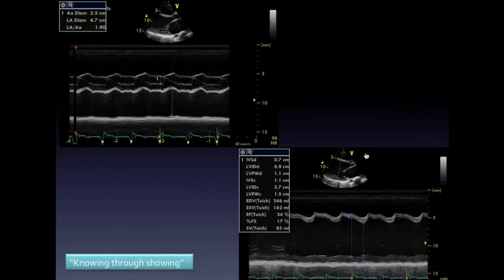So then we take the aforementioned M mode, and the M mode is extremely useful. So this is the M mode here with the area of interest put across the atrium. What I didn't mention, what is extremely important, is that if the atrium is big, that implies certain things. This atrium is big. If the atrium is big, what that is telling you is that either, for example, the patient's in long-standing atrial fibrillation, you have an atrial remodeling. That's not going on here.